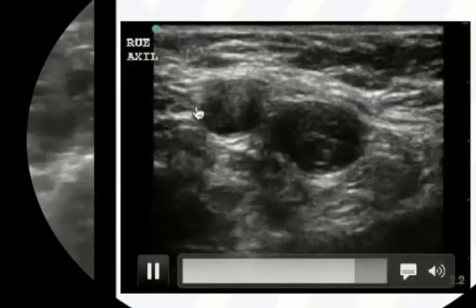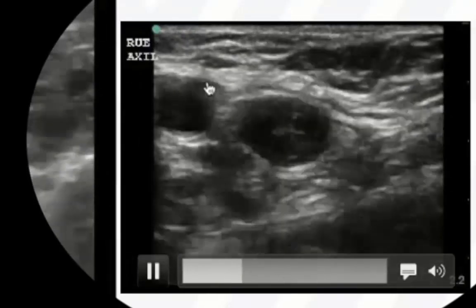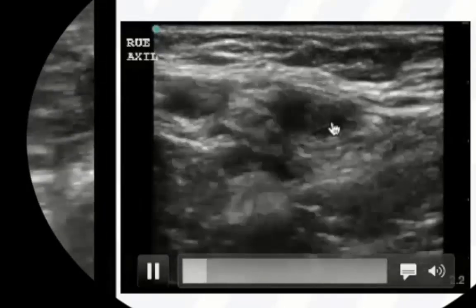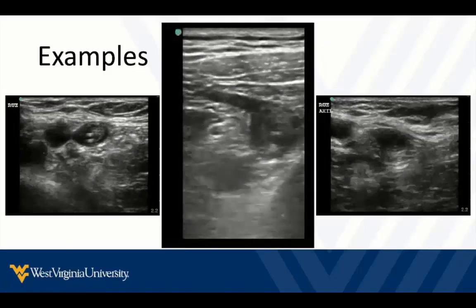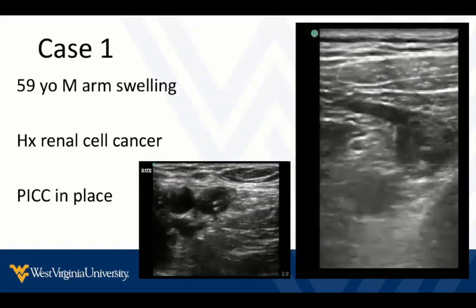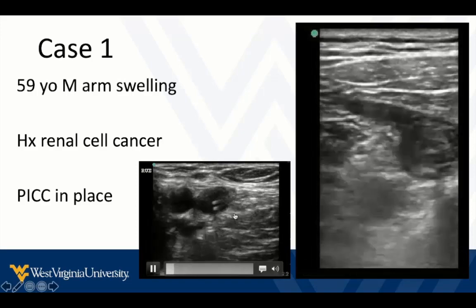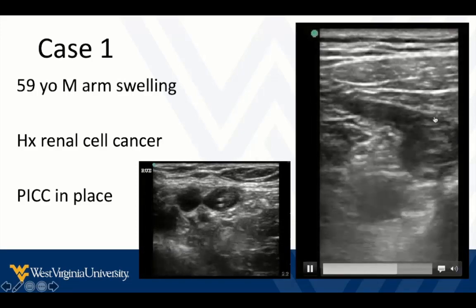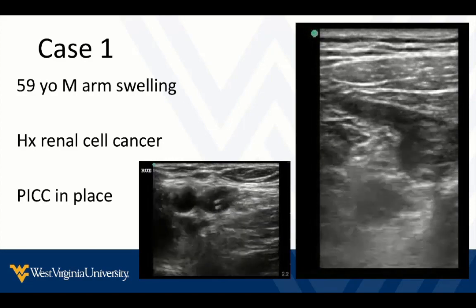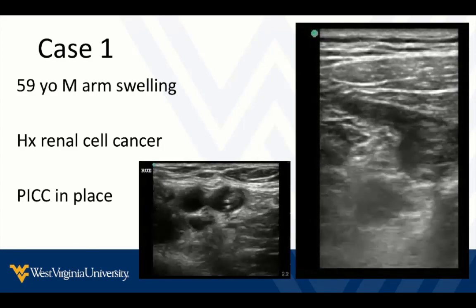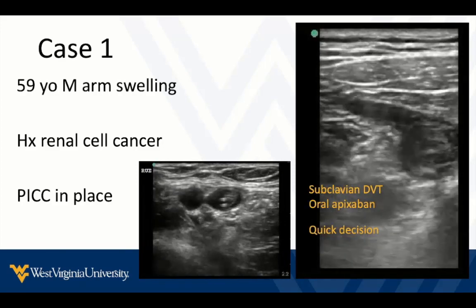Here's another axillary example where we're compressing enough that the artery collapses some, but the vein does not completely collapse — so we have a partial thrombosis. All of these are DVT, and all are enough to make clinical decisions on therapy right away. This brings us back to our case: a 59-year-old male with arm swelling and a history of renal cancer who has a PICC line in place. We see obvious DVT associated with the PICC line and even up into the subclavian. We've moved to direct oral anticoagulants even in cancer patients, so this patient could be treated as an outpatient. Quick decision, immediate, satisfying for the patient, and efficient for your clinic.